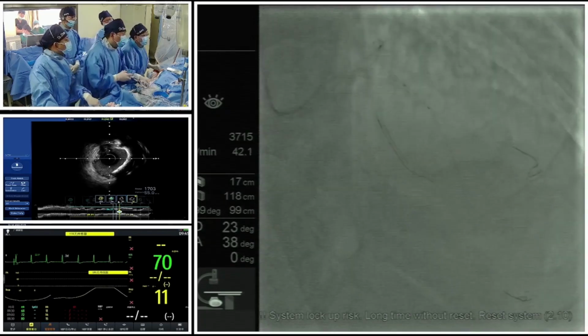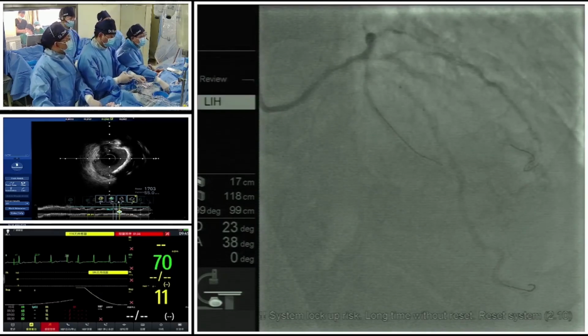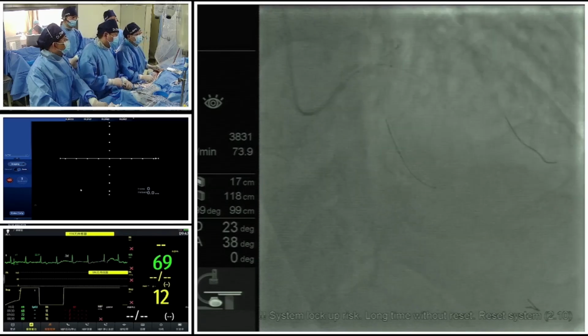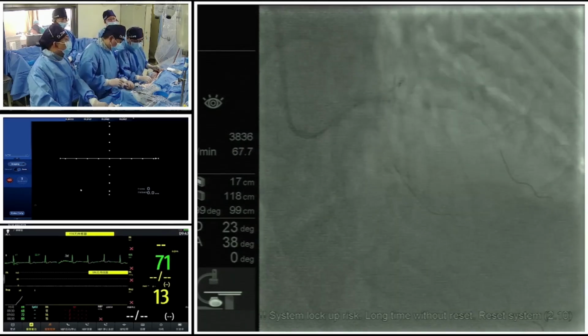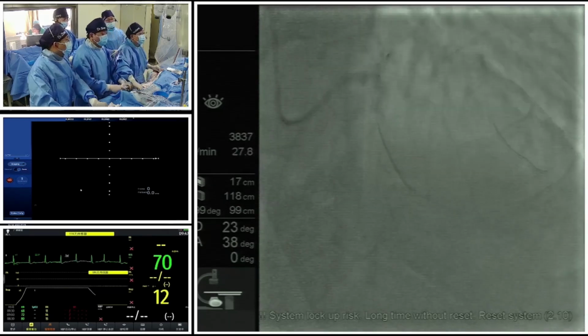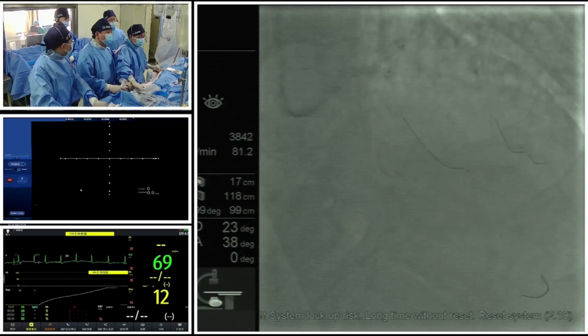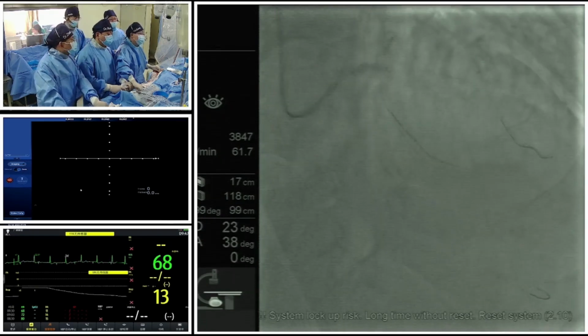It's quite common, right? When we give the shock, we could see the premature beats on the ECG monitoring. So right now we've given 4 shock waves. Do we check the imaging, or do you want to give more shock waves, or one more time?